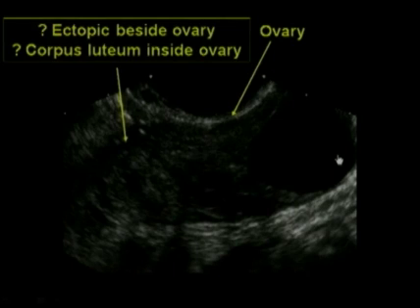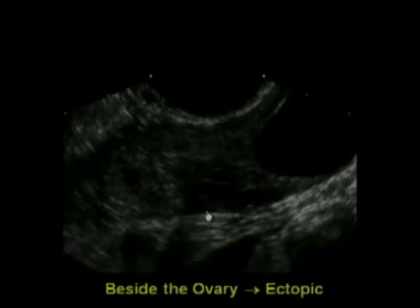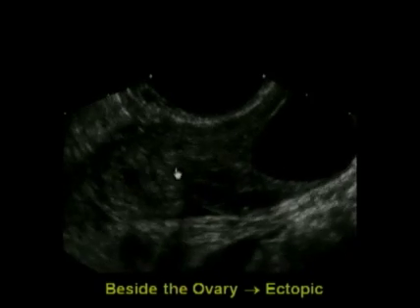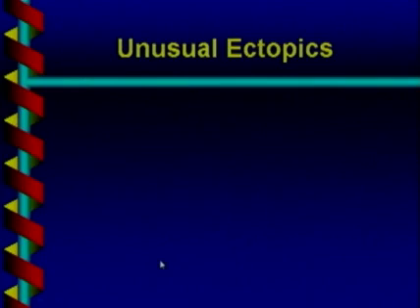This is another similar case. A woman has a positive pregnancy test and symptoms. We do the ultrasound. There's nothing in the uterus. There's the ovary. There's a cyst in the ovary. And there's a mass. Again, is this a corpus luteum within the ovary, or does the ovary end here? And like in the last one, when we push, you can see at the junction between the mass and the ovary, they don't move together. The mass slides along the ovary, so it's beside the ovary. Therefore, she has an extraovarian mass. This is an extraovarian tubal ring. She has an ectopic pregnancy.